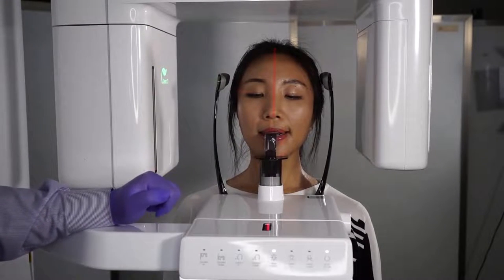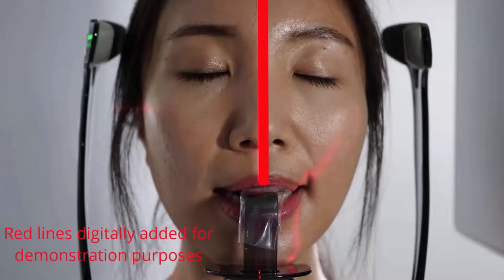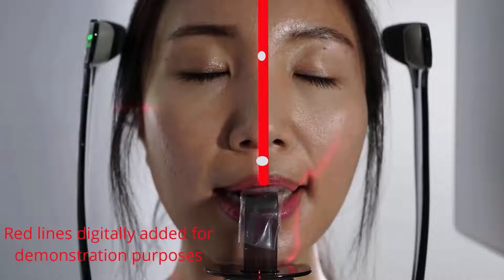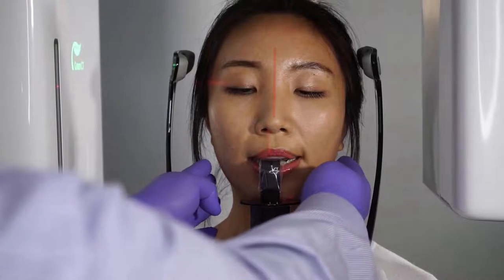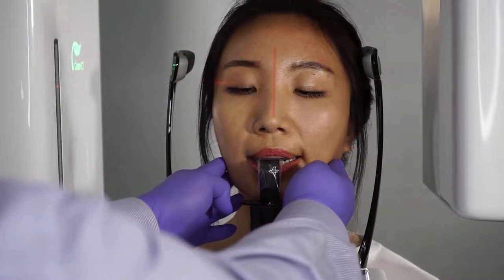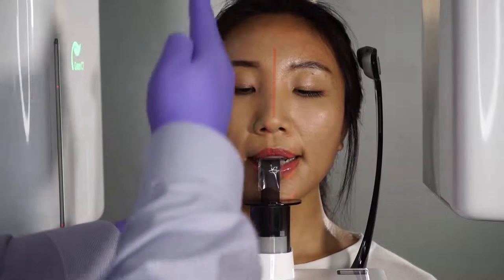Next we will line up the mid-sagittal light, focusing on two points — between the eyes and the philtrum — so that the line runs right through the center of the head. To adjust the position, move the patient's head left to right.